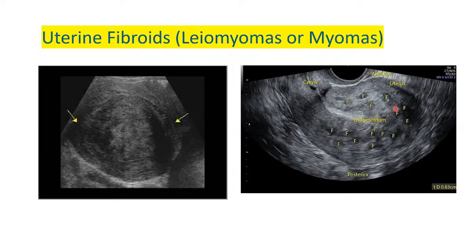Some people would think that these are fibroids. But to me, these are not fibroids. They can also be tiny fibroids, punctate like that. They can be fibroids as well. But to me, look here, you can see there's a cesarean niche, meaning this patient had a cesarean section. That's a cesarean scar there.